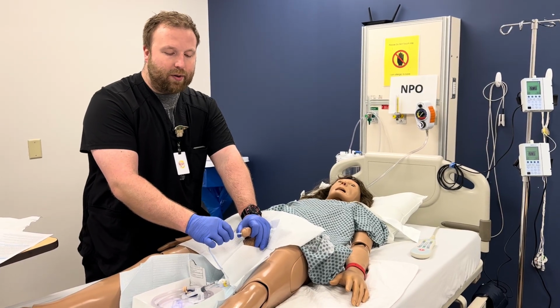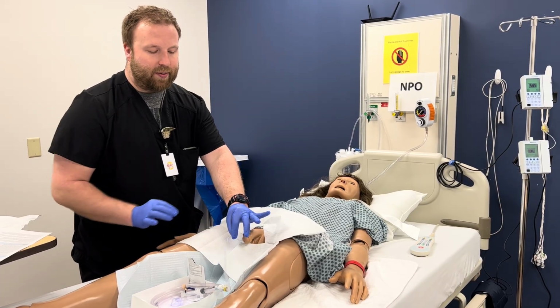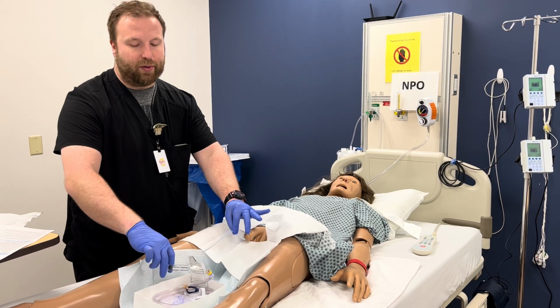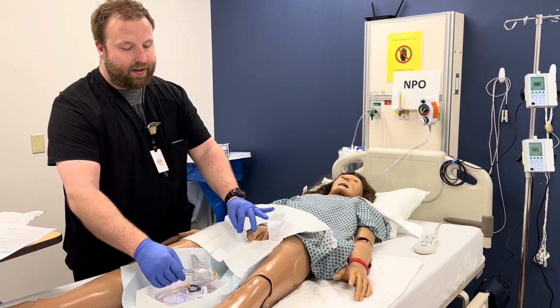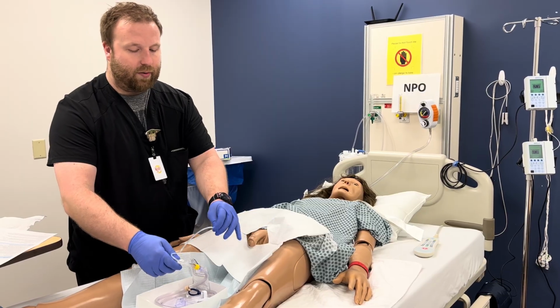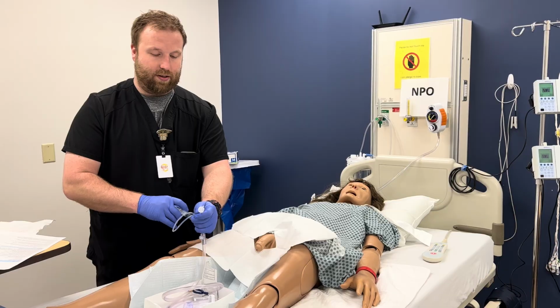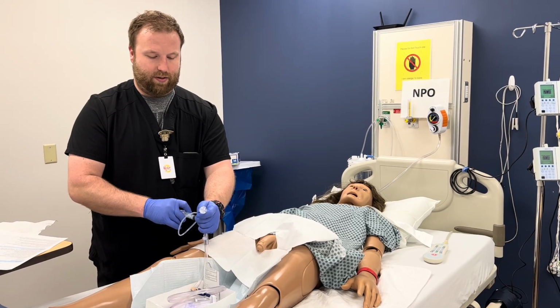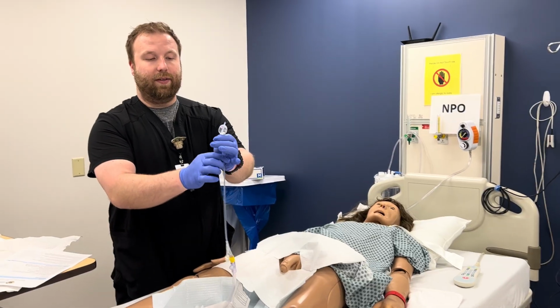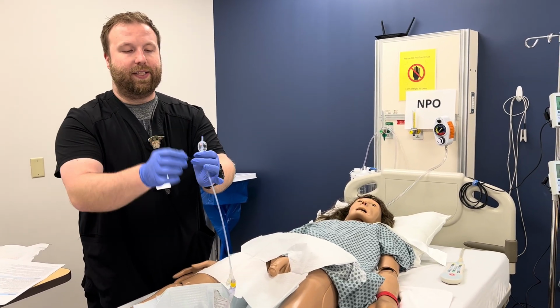When I get to that 1 to 2 more inches, I'm going to release my dirty hand, and I'm going to grab the catheter here. With my dominant hand, I'm going to inflate my balloon. After I inflate my balloon, I'm going to pull back to see if I can feel. And what you're doing here is you're feeling that the tube is inside the bladder. You feel it kind of bouncing in there.